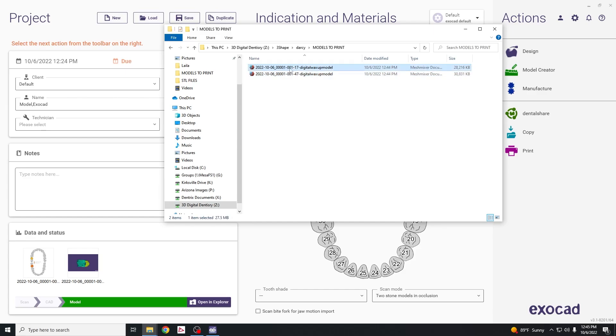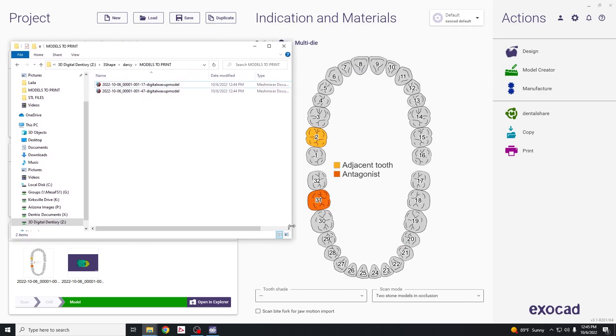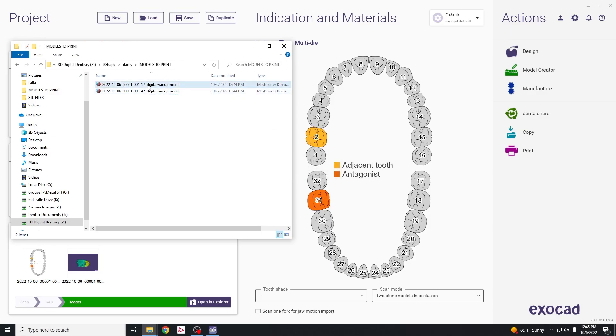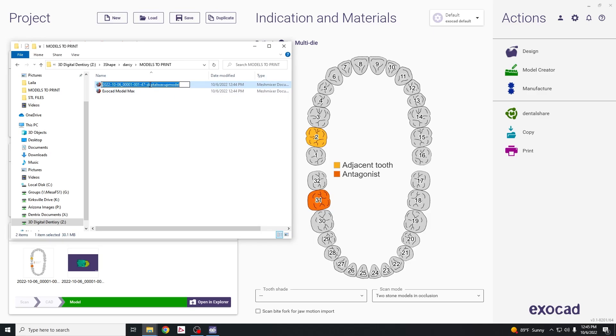Click on the file name to rename it with the patient's name. Pay attention to the numbers at the end. This says one seven, the other says four seven. This is the international numbering system where the first number is the quadrant and seven is the tooth we selected when we originally set it up. This tells us which is the maxillary cast and which is the mandibular cast so label them properly. We'll put exocad model max, and relabel the other exocad model mandibular.